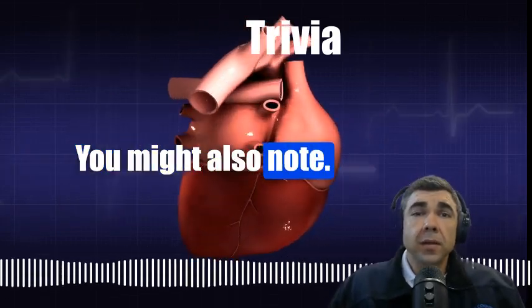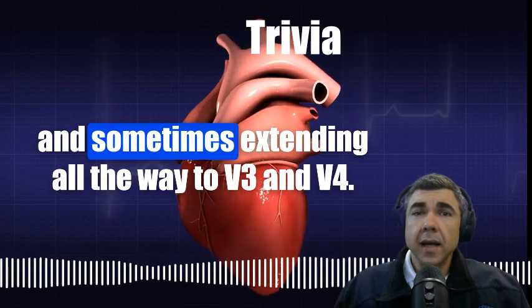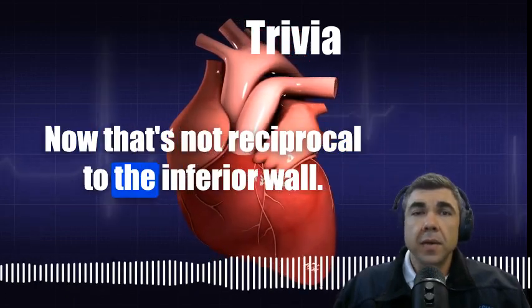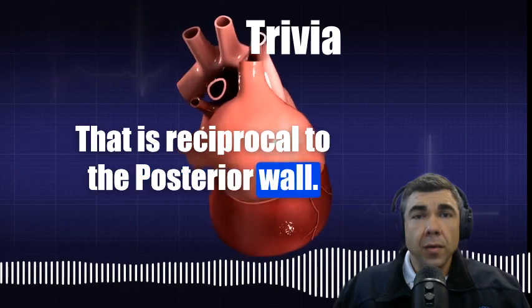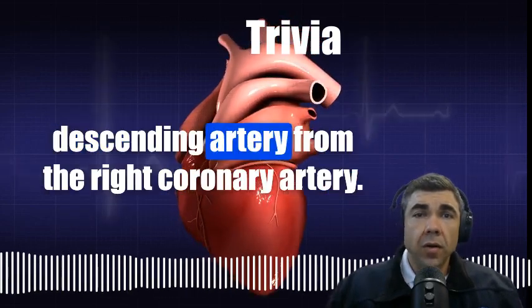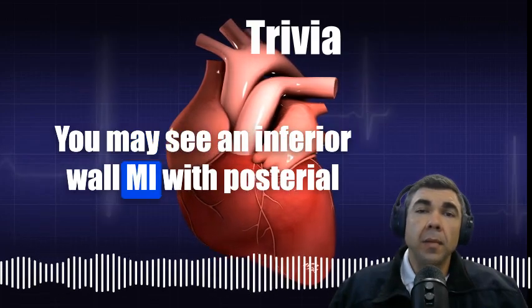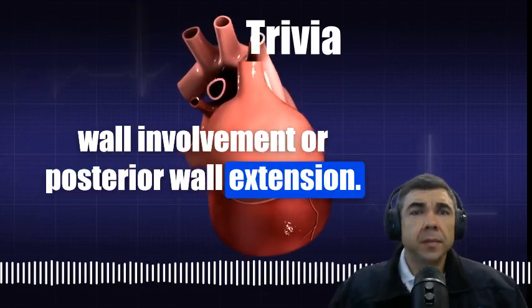You might also note some ST segment depression in leads V1, V2, and sometimes extending all the way to V3 and V4. Now that's not reciprocal to the inferior wall, that is reciprocal to the posterior wall. Because most people receive blood flow to their posterior descending artery from the right coronary artery, you may see an inferior wall MI with posterior wall involvement or posterior wall extension.